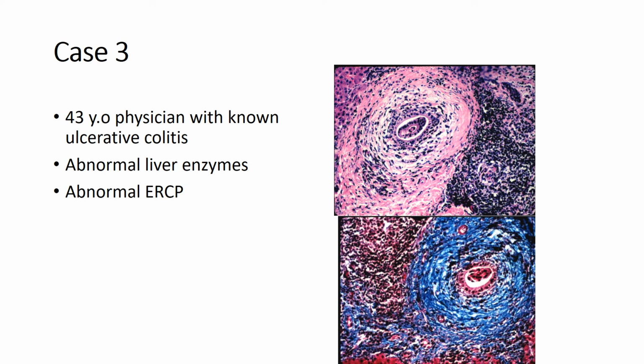Sorry, I have a question. For this florid ductal lesion, we have to have this ductal destruction. Yes. So the question is whether a florid duct lesion involves duct destruction. That's basically the definition of a florid duct lesion. So the bile duct is surrounded by inflammatory cells, and you have intraepithelial lymphocytes, you have basement membrane destruction, you have the histiocytes and lymphocytes surrounding that bile duct.